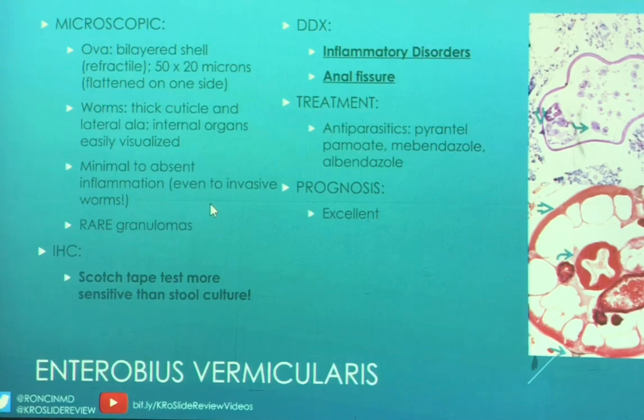The interesting thing to note about pinworms is that even if they are invasive, so even if you have worms within the appendiceal wall or the intestinal wall, there will be minimal to no inflammation and very rarely associated with granulomas.